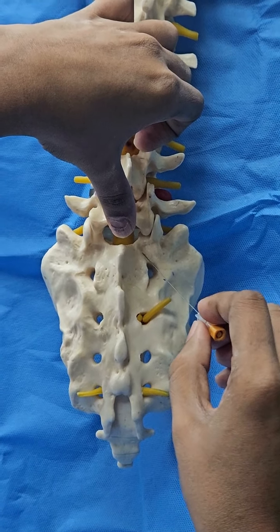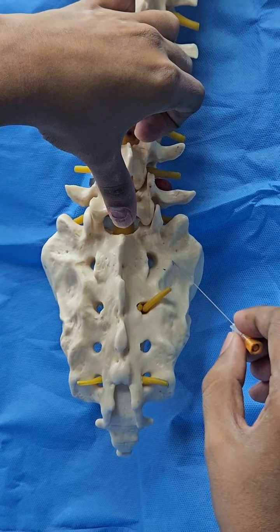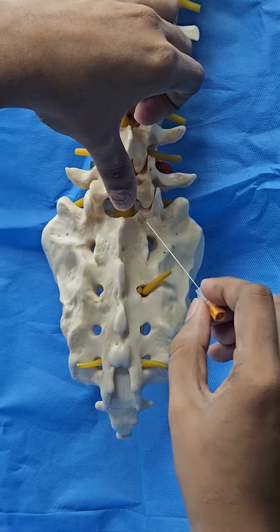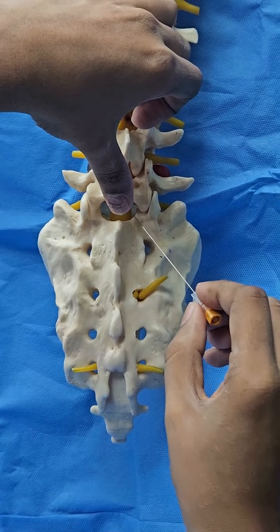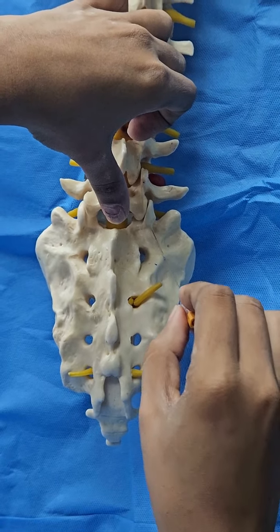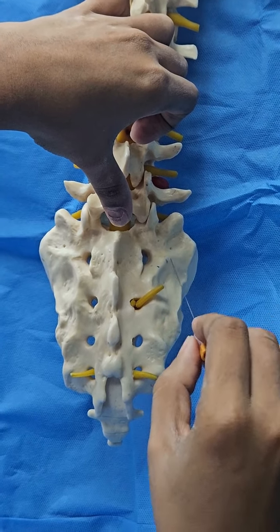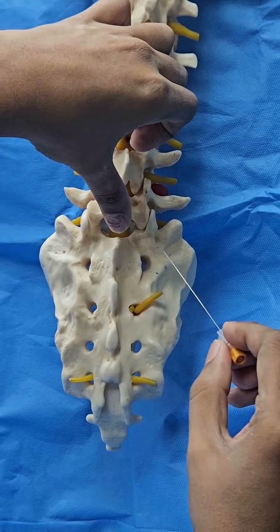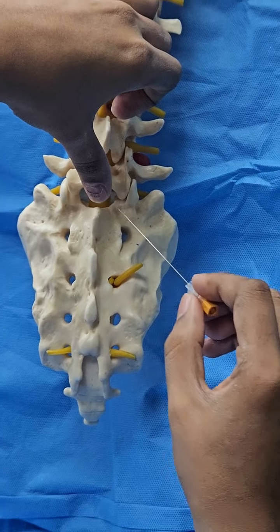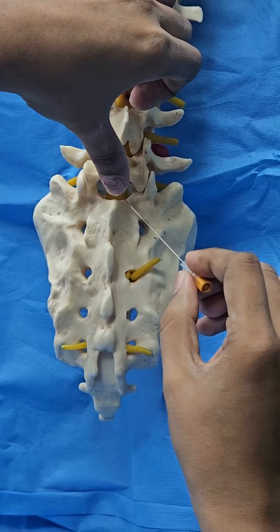Sometimes you might hit the sacrum — come back and increase the cephalad angle to redirect into the space. Sometimes you may be too lateral and hit the facet joint. In that case, redirect more medially. This guiding hand and finger will give you a good idea of how your trajectory is going to be. This is the Taylor's approach.